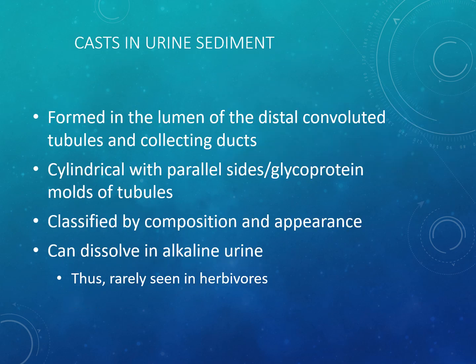Okay, so one of the other things we can see in urine is casts. If you remember the nephron again, the urinary casts are formed in the nephron's distal tubule. What happens is there's a protein in the tubules called the Tamm-Horsfall mucoprotein. It's excreted there, and it acts almost like a gelatin, and it aggregates and pulls all the sediment together in the tubules, and it makes a mold of the tubules, and that's why they got the name cast.